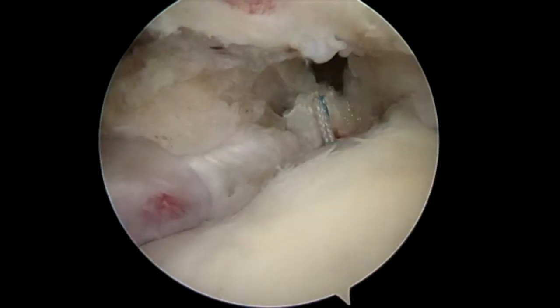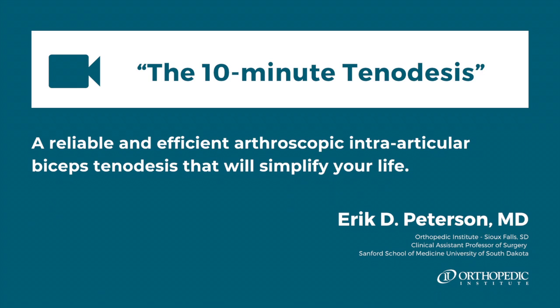All in all, this was a real-time video and it took about only five minutes. This is a hyper-efficient way to arthroscopically deal with pathology. Cynics will say you need to bury the bicep tendon directly into the bone with an interference screw — but I've performed this arthroscopic biceps tenodesis procedure over 1,200 times, and the fixation failure and reoperation rate combined is less than 1%. It allows anatomic fixation and anatomic tension to the bicep, can be done all arthroscopically, doesn't add a lot of time to the case, and effectively treats very common bicep tendon pathology in the shoulder. I hope you've enjoyed this. Thank you.